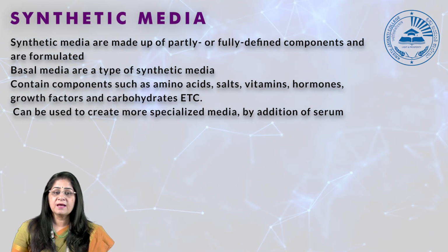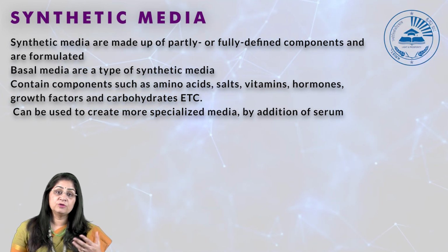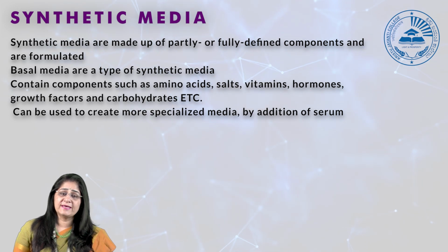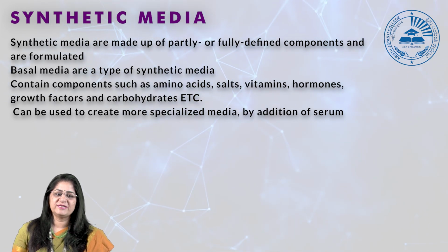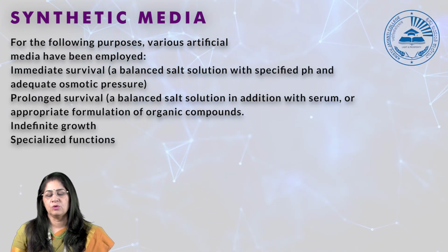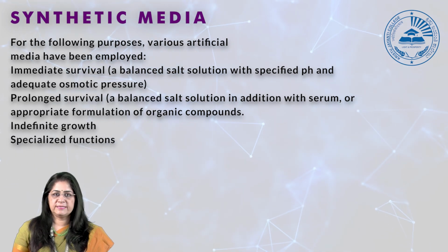So synthetic media are made up of partly or fully defined components and they are usually formulated. And it contains amino acids, salts, vitamins, hormones, growth factors and carbohydrates, and it can be used to create more specialized media. Depending upon what you are working with, your media can be specialized by addition of serum.